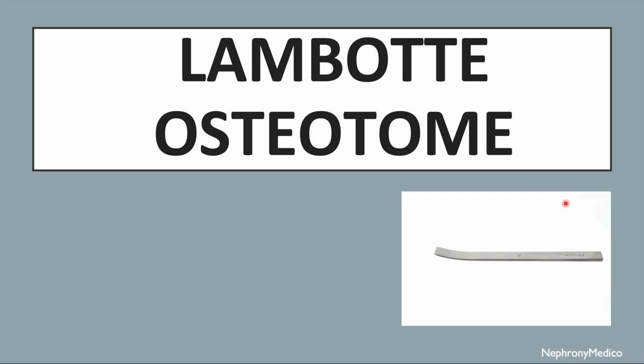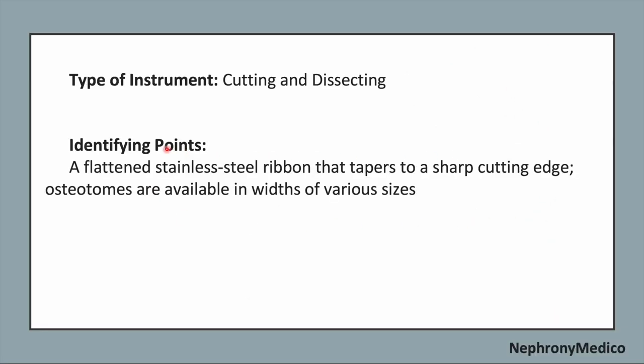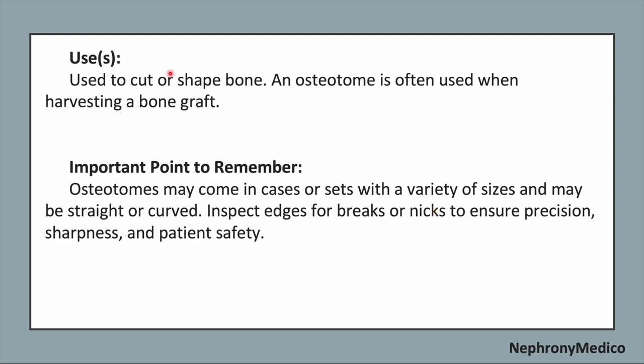Let's talk about Lambotte Osteotome. This is a picture showing Lambotte Osteotome. It is a cutting and dissecting type of instrument. Identifying points. A flattened stainless steel ribbon that tapers to a sharp cutting edge and the osteotomes are available in widths of various sizes.